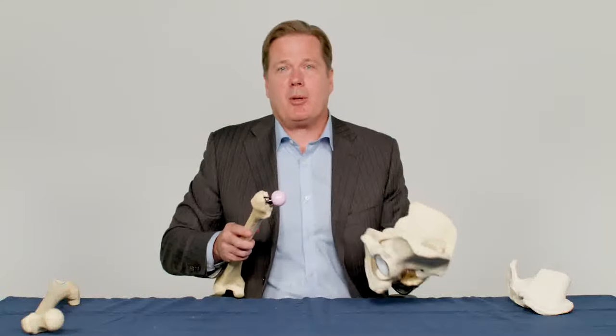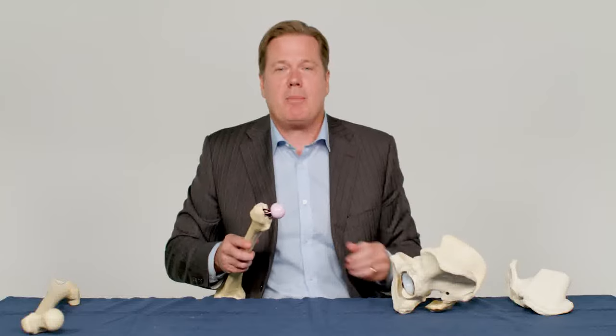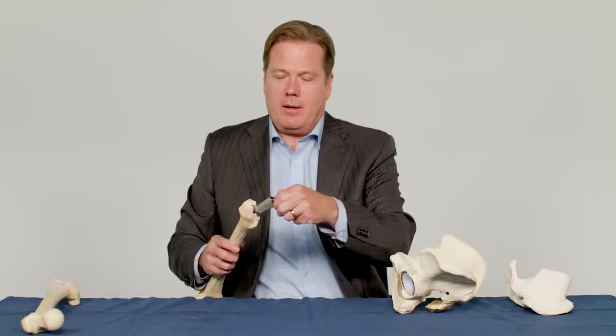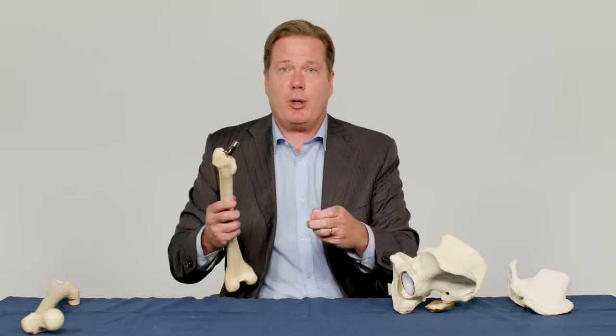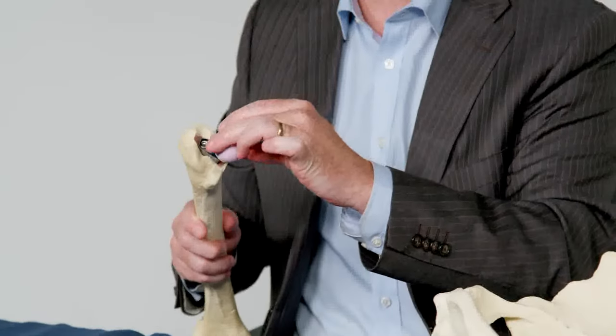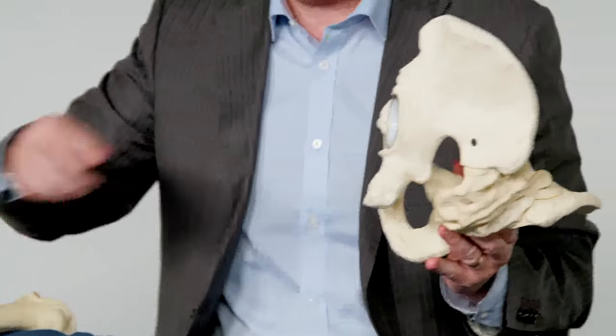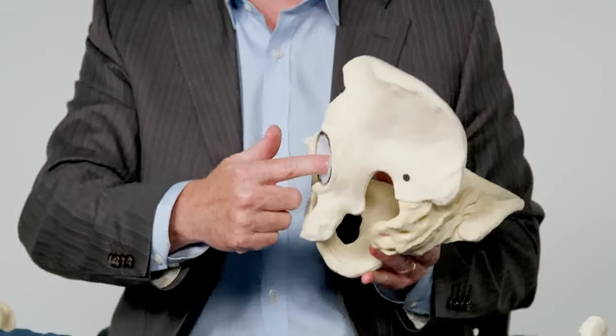The hip replacement prostheses used today are usually made of a titanium femoral stem that is press fit into the femoral bone, with a ceramic or cobalt chrome femoral head, along with a titanium cup with a cross-linked polyethylene liner.